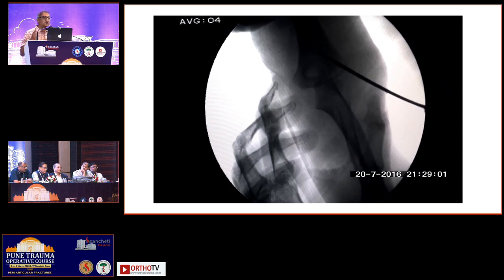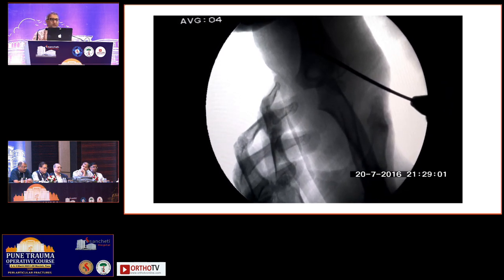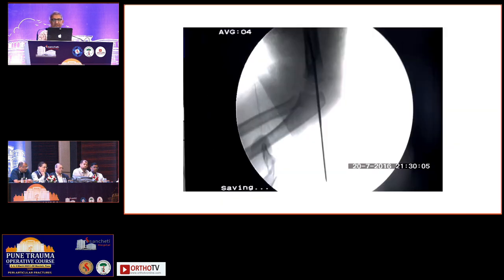And this has to be done also in the internal rotation view, not on an AP view, because the lateral condyle fracture is posterolateral. If you drill in AP, you will not get it right. You have to put the patient in internal rotation view. And how do you know this is internal rotation view? Radius and ulna are overlapping. If radius and ulna are not overlapping, then it is a proper AP view, which you don't want. And this is how it should look on lateral.